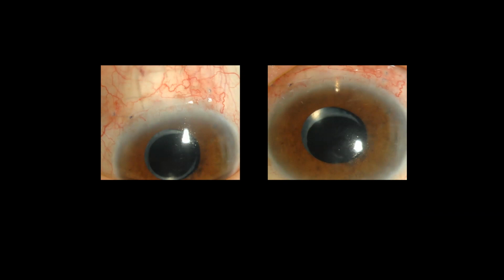What kind of surgery? I can see superior. There's a bleb. There is something here on your right hand. Yeah, I'm not sure. Is it a tube? So that's a shunt, small shunt, mini shunt. Yeah, so that's Express shunt, Express mini shunt. Yes.